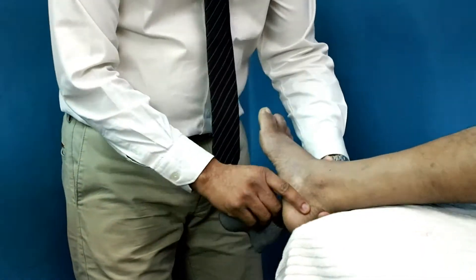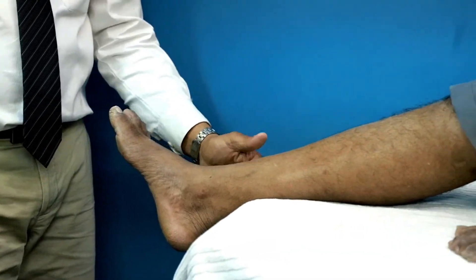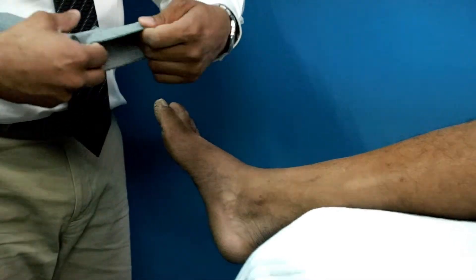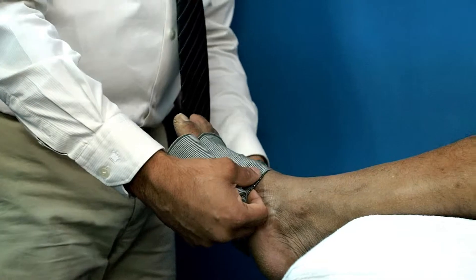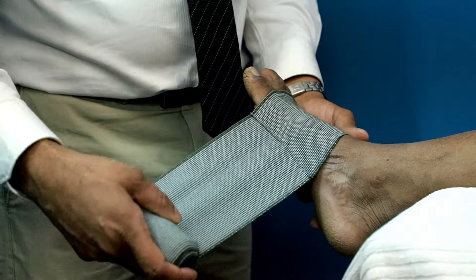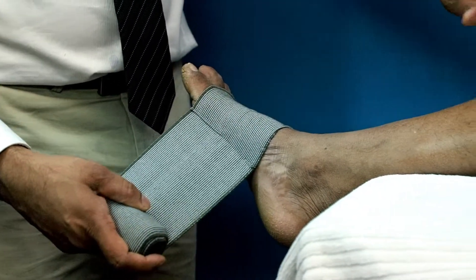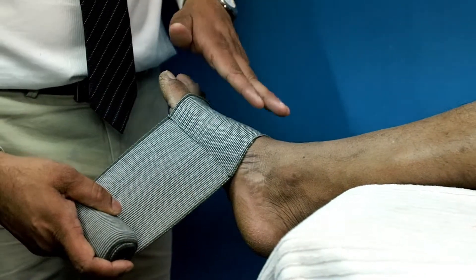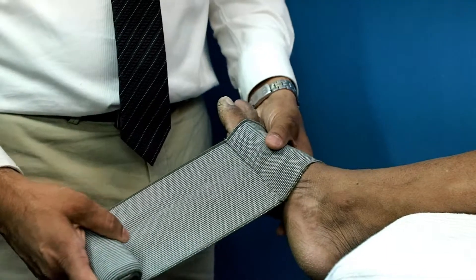So how we need to start: we need to make the patient lie down comfortably with the leg hanging at the edge of the table or the bed. We need to put the foot in the slot like this. This is a long stretch compression bandage and we will be applying it in a graduated manner, as in the pressure will be more at the level of the foot, and gradually as I go up, I will be reducing the pressure by stretching the bandage lesser.